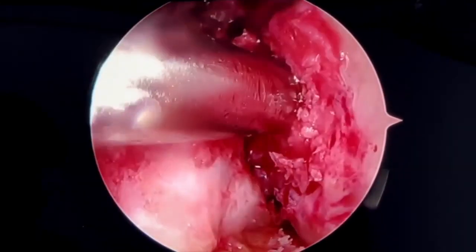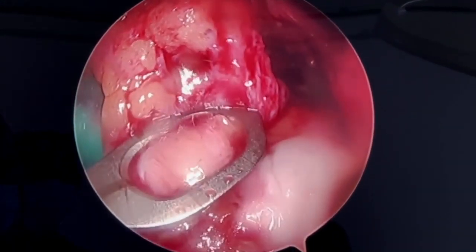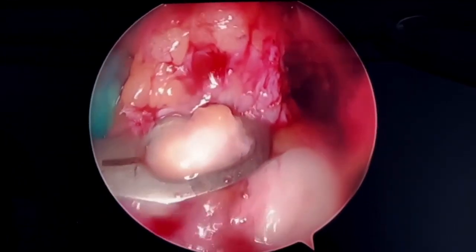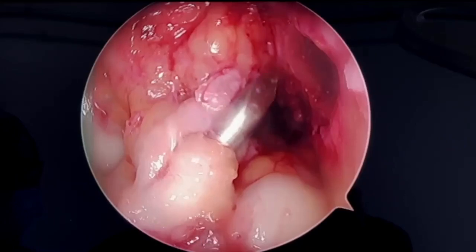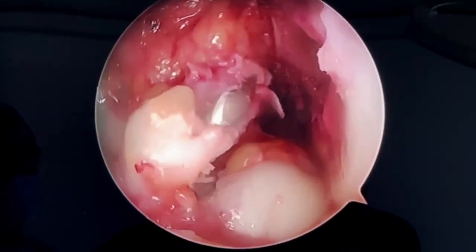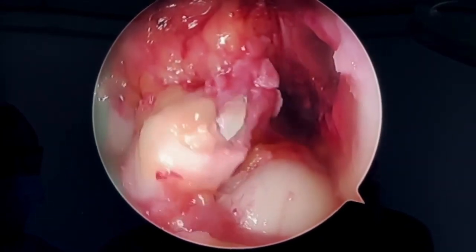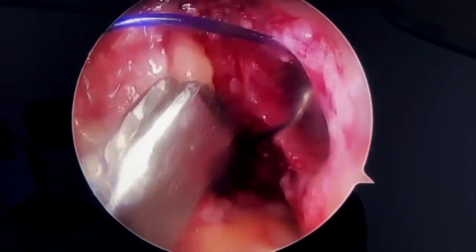Any remaining bone or soft tissue is irrigated and removed using saline. The tibial guide is positioned at a 55-degree angle to target the center of the ACL stump. The cannulated drill set is then used to ream the bone from the outside in based on the previously measured ACL graft size. The synovial covering of the ACL remnant and the tibial attachment are carefully preserved throughout the procedure.